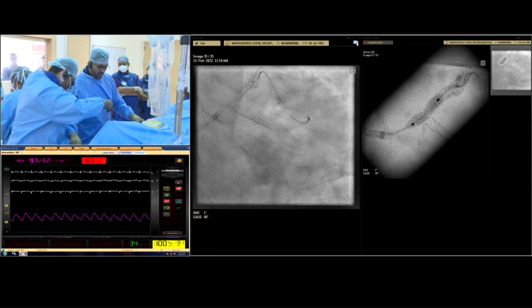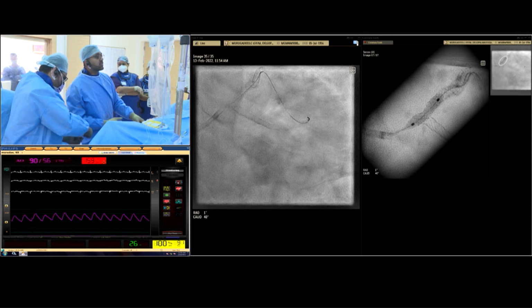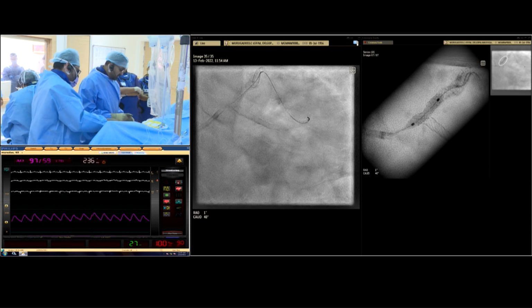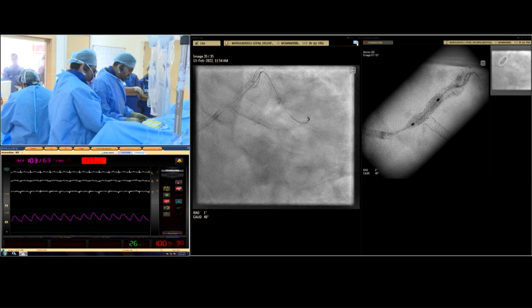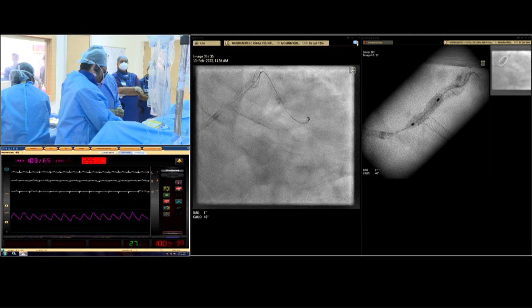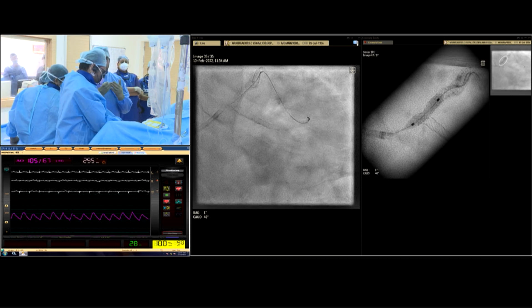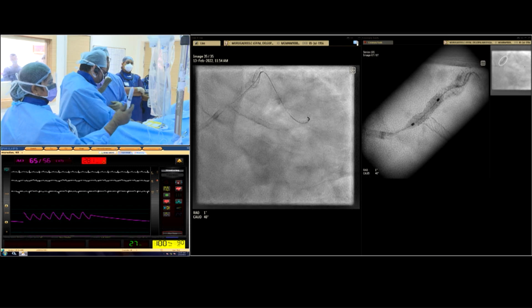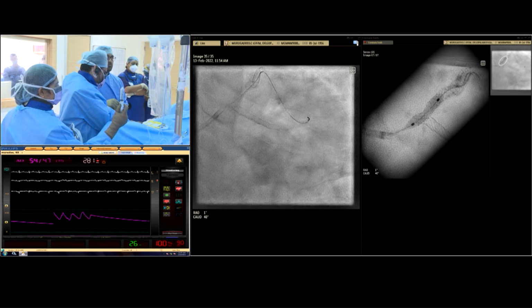And even for IVL, one of the points I wanted to demonstrate, but I didn't show it, I just went very quickly, was that the lithotripsy balloon, as many know, is very bulky. With this amount of calcium, once you come back, it's very difficult to go forward. So it's always best to start backward and come distally and then proximally.